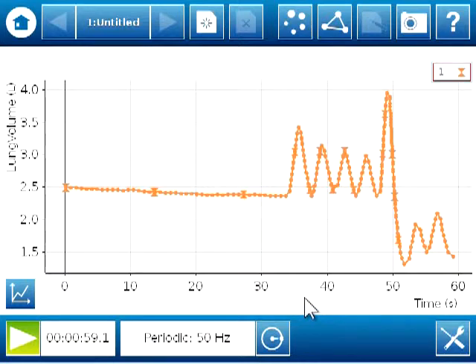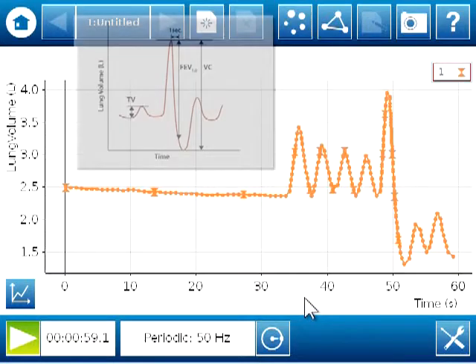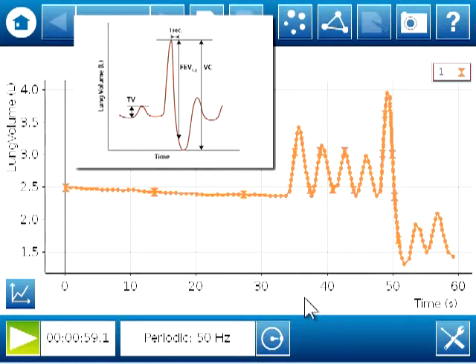Now, the normal breaths will give us information about something the scientists call tidal volume, while the maximum inhale followed by a forced exhale gives us additional information about vital capacity and forced expiratory volume in 1 second. And these are values that would be important when analyzing, say, a person with asthma and whether or not a treatment is improving the lung functioning of that person with asthma.